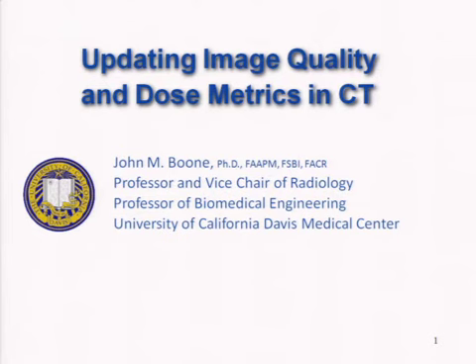Well, the user community, both radiologists, referring physicians, and patients' parents, are becoming more savvy with that. We have heated discussions about the use of effective dose, the K factors, because effective dose was never really meant to characterize a patient's dose. It was meant to be a generic patient's dose because it's based upon risk factors from a whole different group of people than that patient on the table.